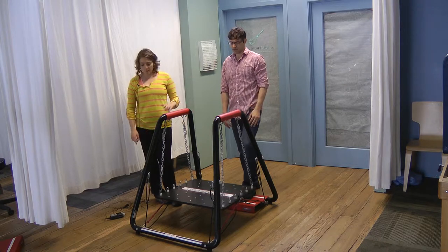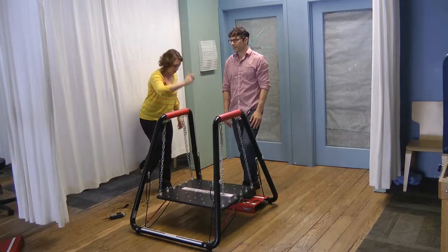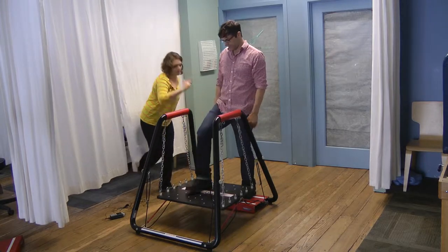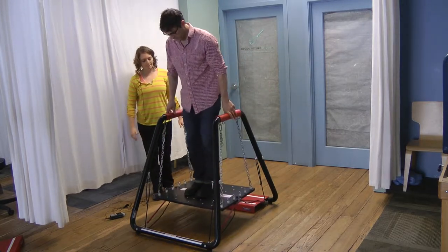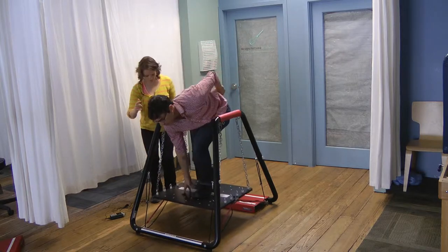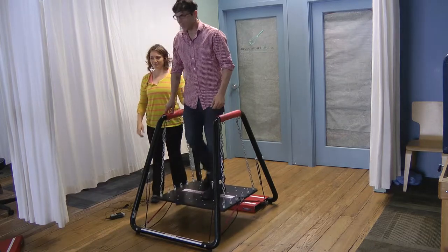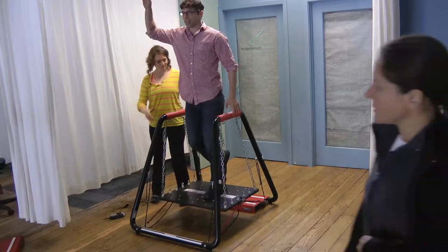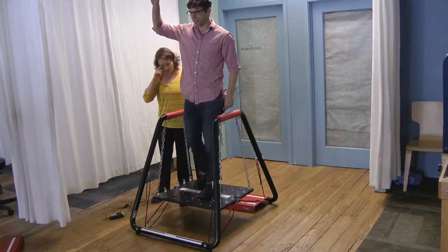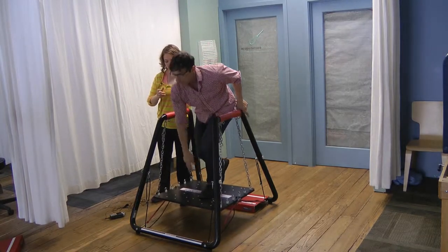You could have it up here, keep it flat, and then he would stand on one leg, drop it down, and then pick it right back up. You come down and across, and then you come all the way up to standing. This is tough — yeah, this is pretty tough. This is definitely one of the more advanced settings, for sure.